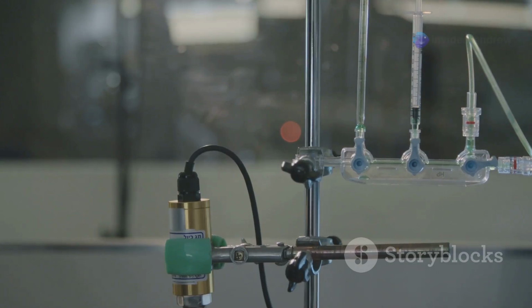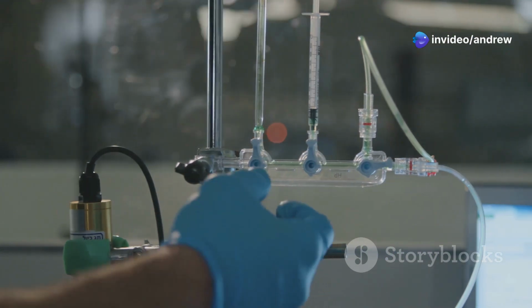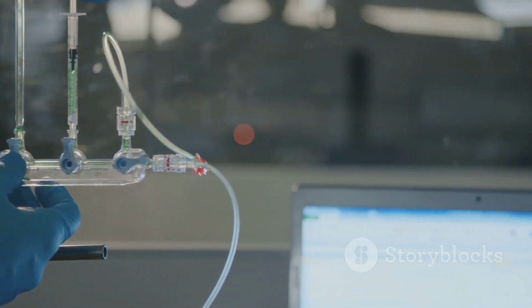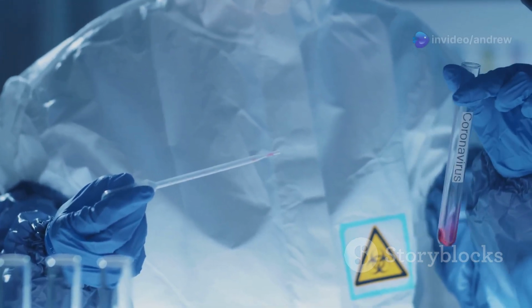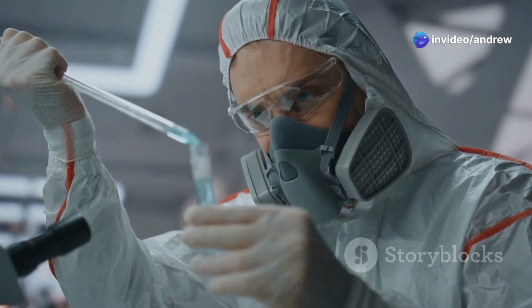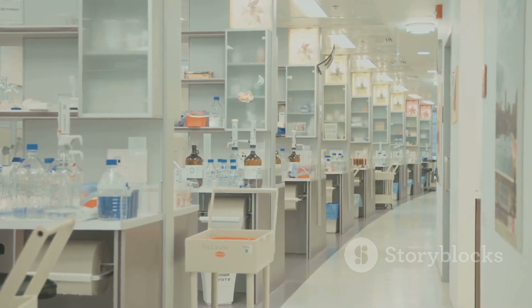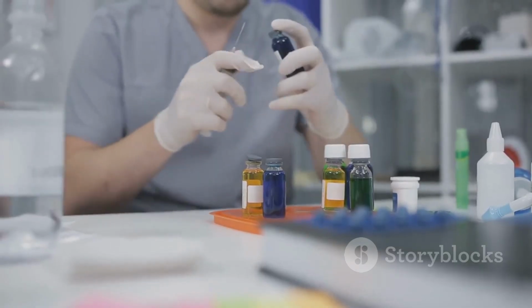It is essential to remember that these tests are presumptive and should always be followed up with confirmatory tests, such as gas chromatography and mass spectrometry, to definitively identify the drug. Furthermore, safety is paramount when performing any chemical test. Always wear appropriate PPE, including gloves, safety goggles, and a lab coat. Work in a well-ventilated area or under a fume hood to minimize exposure to hazardous fumes. Dispose of all chemicals and materials properly according to local regulations.